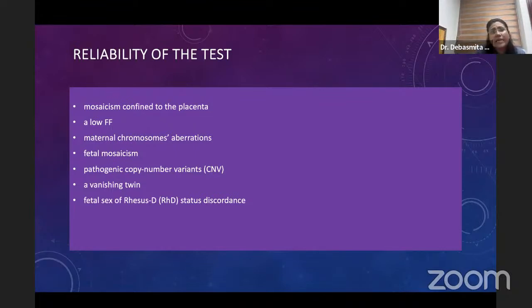We have faced cases like single ventricle and single atrium. We found it around 16 weeks, but the NIPT showed low risk. So naturally, whenever there is a frank anomaly that we are showing on the ultrasound, invasive testing is the golden rule that we need to understand. So for deciding between NIPT or amnio, it is the ultrasound. We have to go for phenotypical correlation in a very good way, in expert hands, keeping all kinds of images and clips, so that it can be beneficial for later.